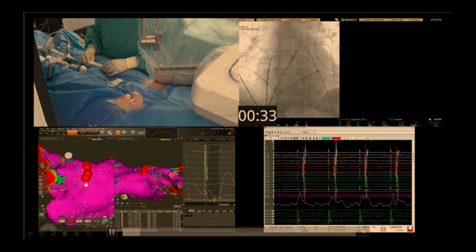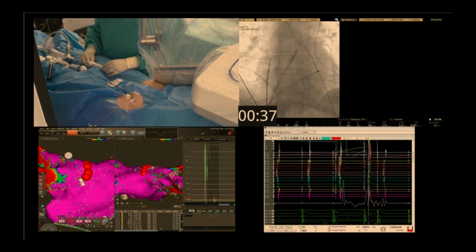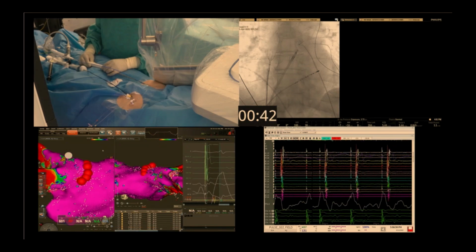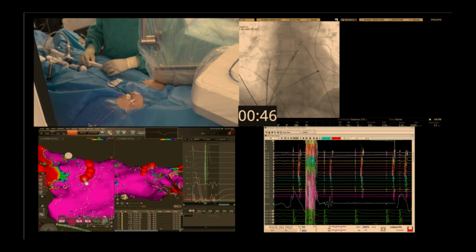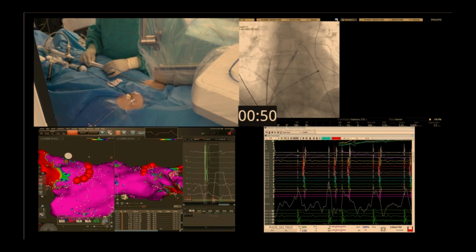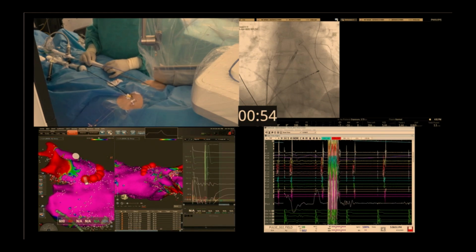But notice here, again, I have no idea why we're having this location issue, and it's actually a CARTO issue, because even when we disconnected everything, just the octave catheter was flying around. Anyway, most of the cases go like this. I'm just going to let this play, and as it plays, hopefully you get a feel for what the workflow is.